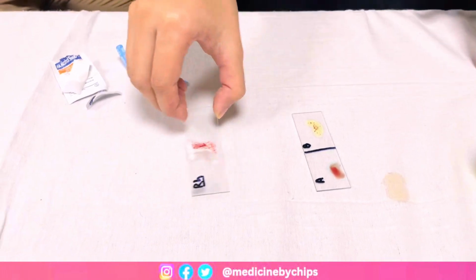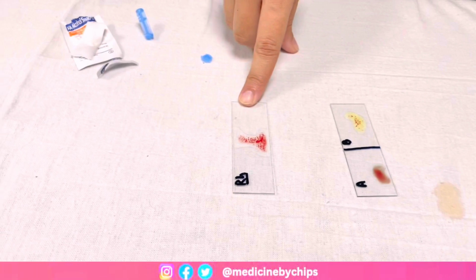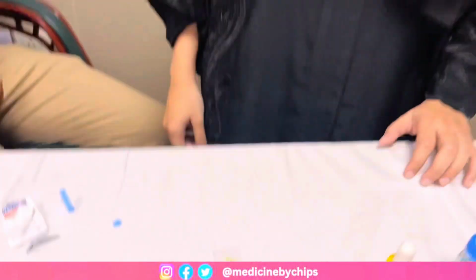So as you can see, there is clotted blood over side B and also on the RH side. So this patient has blood group B positive. And that's it for our practical. I hope you have understood everything.